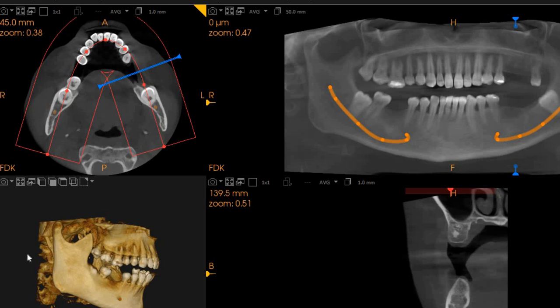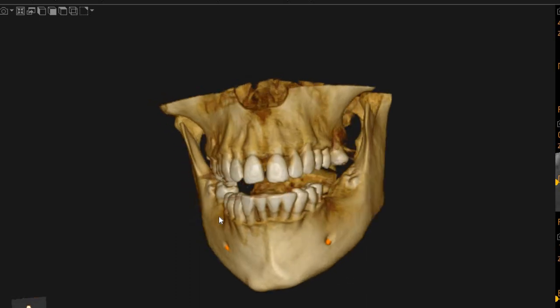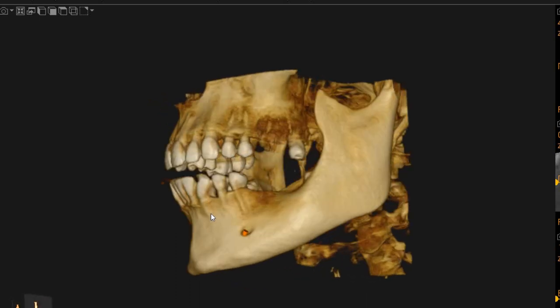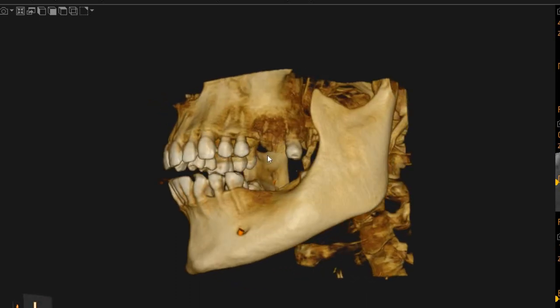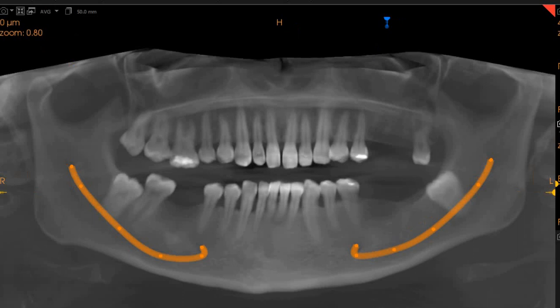Hello, Assalamu Alaikum. Ultra Scan Diagnostic Set. This is the CBCT of the patient that you have requested. The areas of interest are the lower right, upper left, and lower left for implant placement. This is the panoramic view.